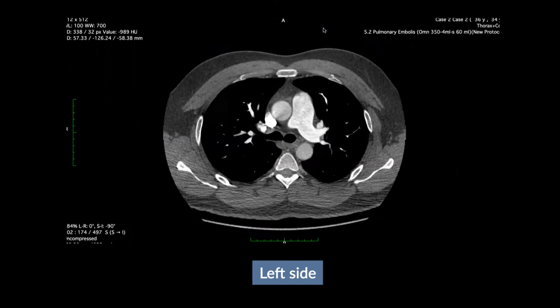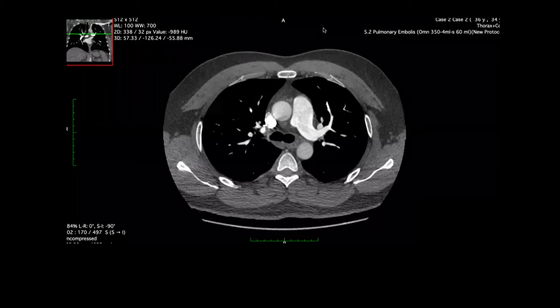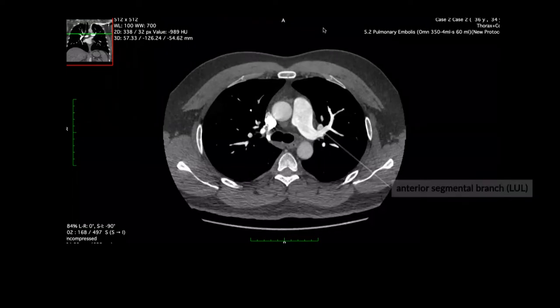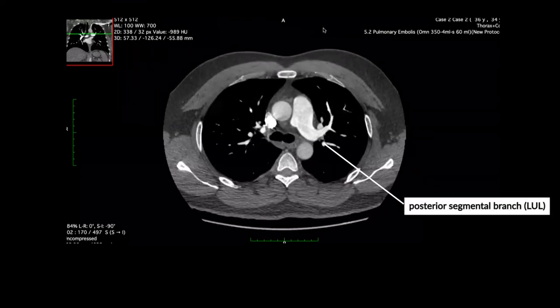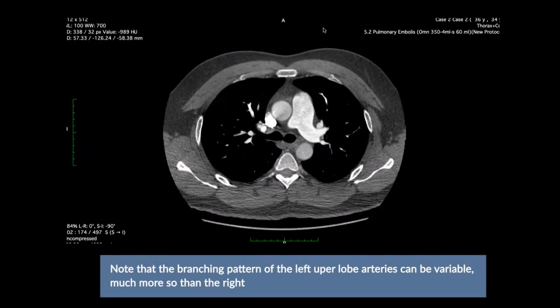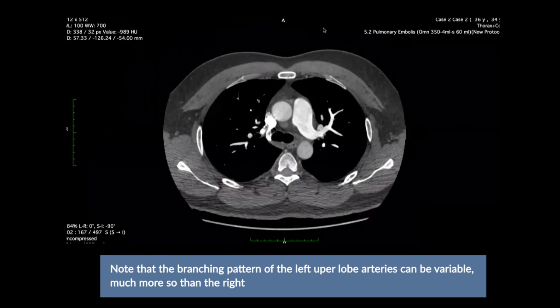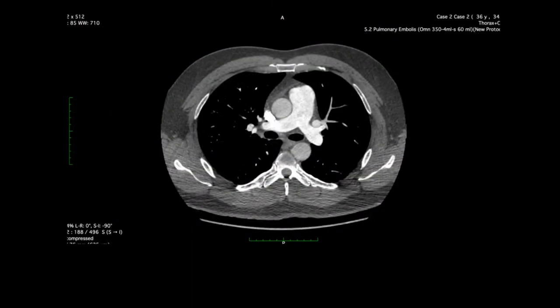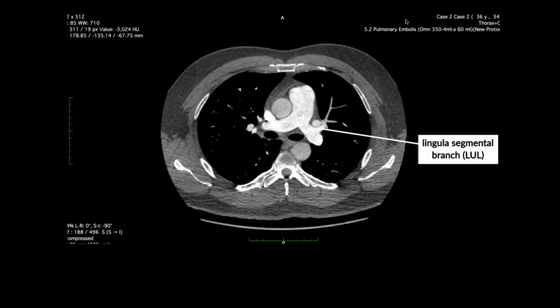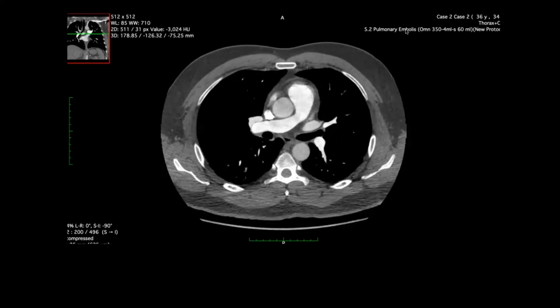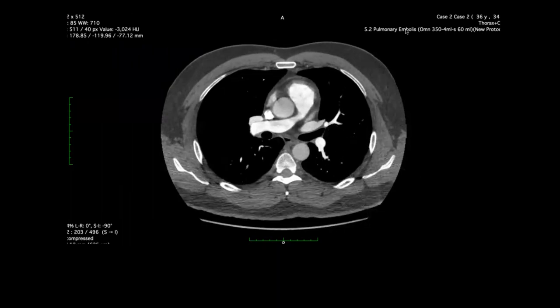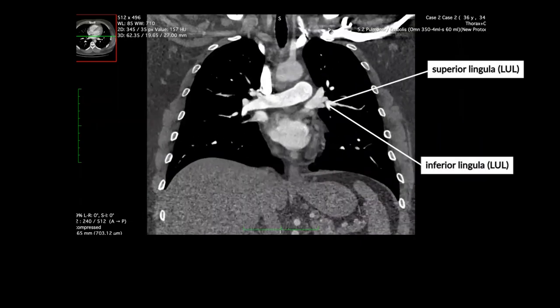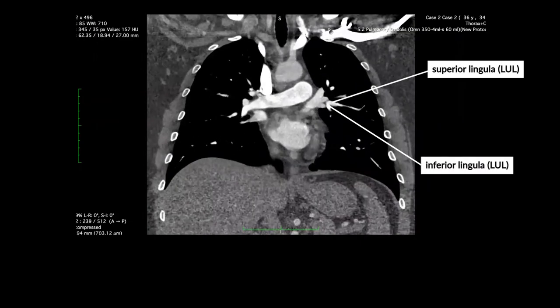Now moving back up to repeat the same for the left side, we follow the branches to the left upper lobe. Here we have the anterior, apical, and posterior segmental branches to the left upper lobe, and we follow each of these out separately. Then we look at the lingular segmental branch, which comprises the superior and inferior branches. The superior and inferior lingular branches can be better appreciated on coronal images.